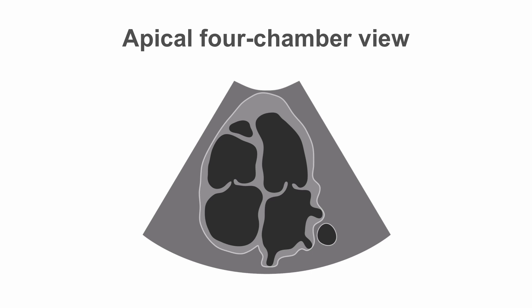Our probe is positioned at the top of the screen. The first structure we're going to image is the LV apex, and then the cavity of the left ventricle. We have the right ventricle here, the right atrium, and the left atrium. This is the mitral valve.